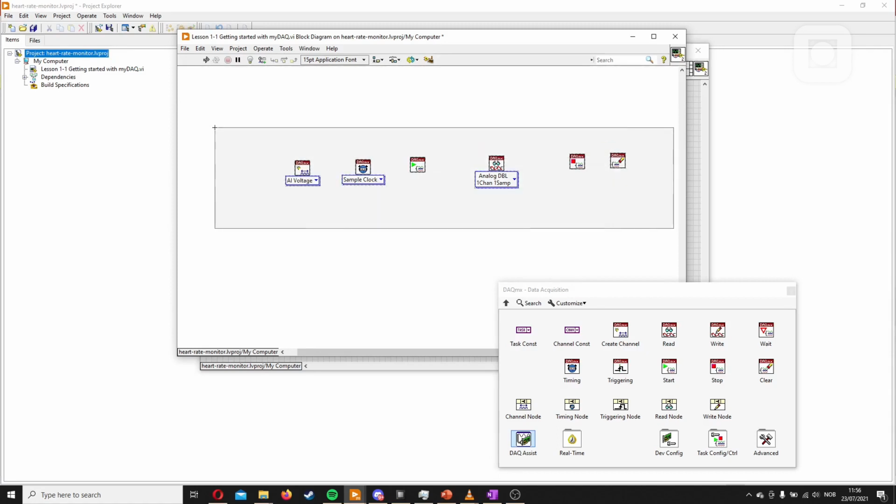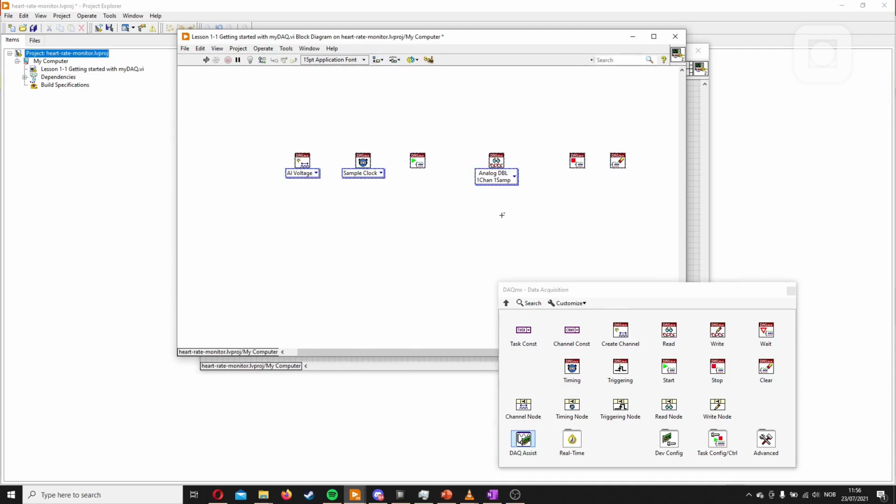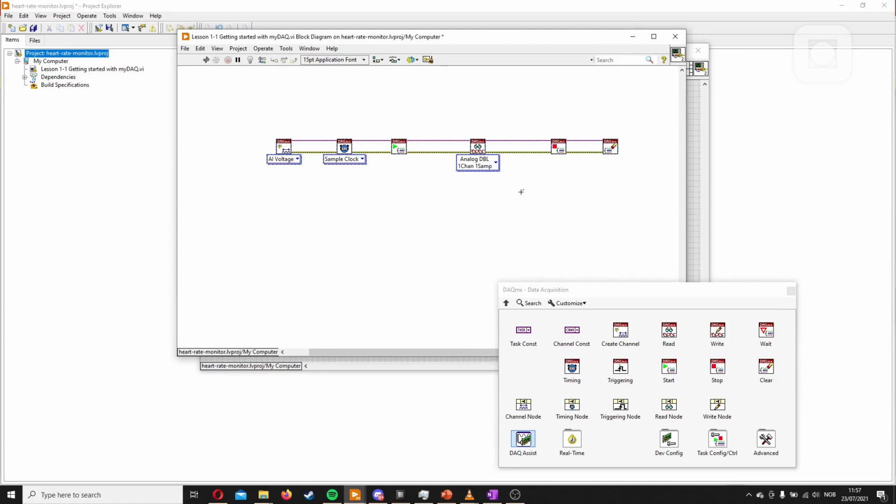A handy function when doing this is just to select this one and they will line up. Another handy thing you can do is hold Control. First press space without letting go of Control and then press W. And this will automatically wire up all of the boxes together if they have the same wire. If they don't, they will get an error, but then you can fix that.